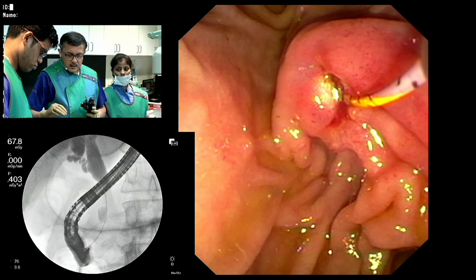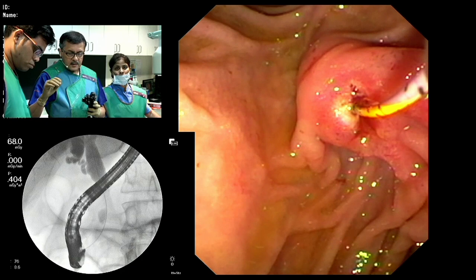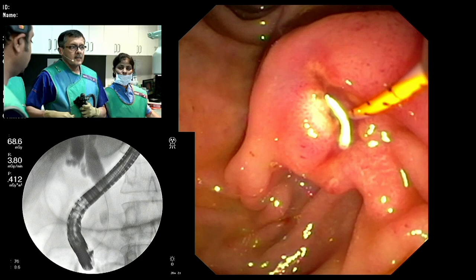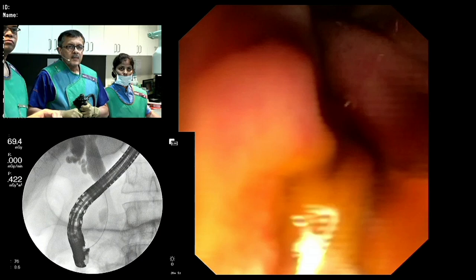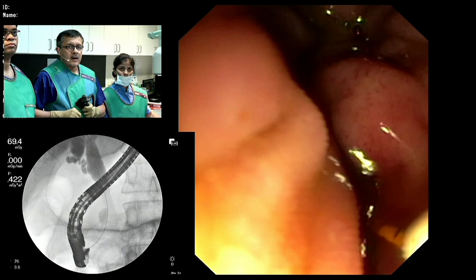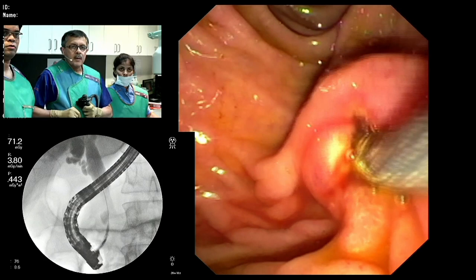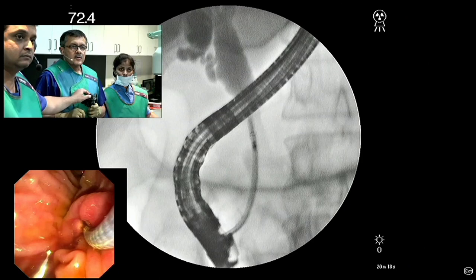So Amit, you see here, this is the, yes, Rob? Amit, the Terumo wire that you used, it's so torqueable, it's the short Terumo, correct? Yes. That's why you have to change to another wire for the exchange and for the stenting. Exactly. Sometimes we also can place stents on the Terumo itself, because we use the technique of water irrigation or saline irrigation so that the wire does not come out. You have to pull the wire, and as the wire is being pulled, I'm passing the stent inside. The assembly is very rigid, but it's a very nice assembly to go across tight strictures. So you see here that this is the place where the stricture is quite tight.